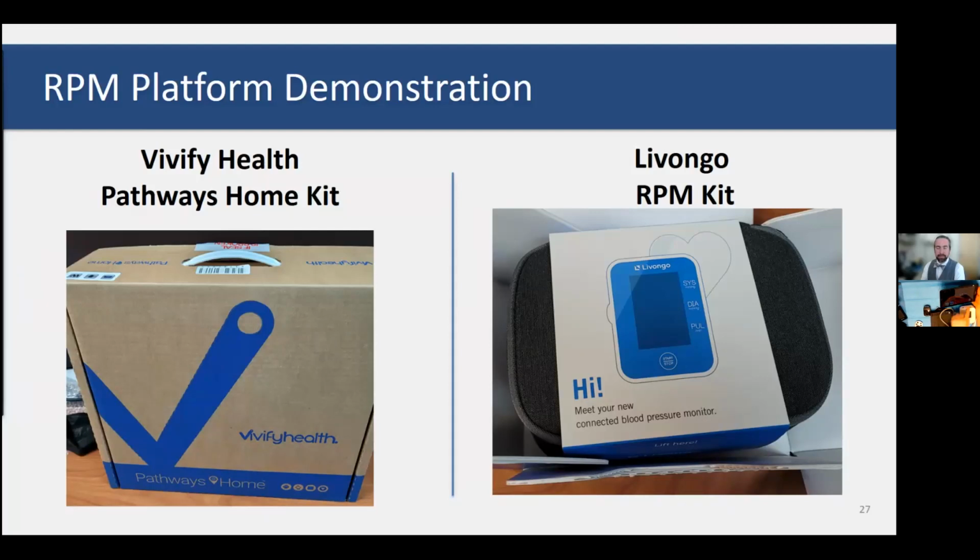perform the different exams. So I've got buttons here that are red. They're saying I need to perform the exams. That beeping that you heard earlier was actually this alerting me, hey, you've got tests that you need to do. So in addition to the beeping, which you can hear now, it will actually walk me through how to perform the different tests. "Please place cuff around upper arm for blood pressure measurement." So you can see it's using the text to speech built into the tablet to walk me through it.